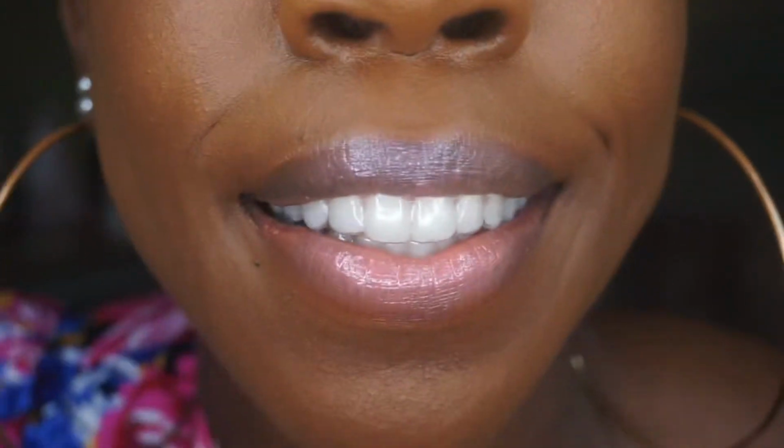I wanted to take this little commercial break to show how you can remove your Invisaligns. Again, I am currently wearing my retainer, and you just remove your retainer the same way that you remove your Invisaligns, by using your thumb, and you'll find it much easier doing it that way and much less painful.